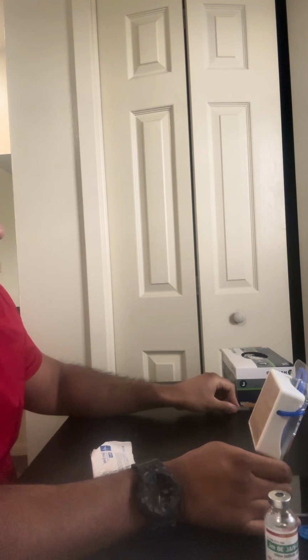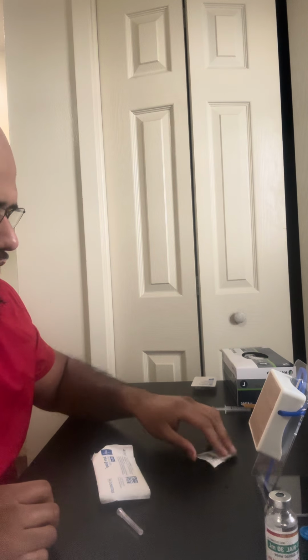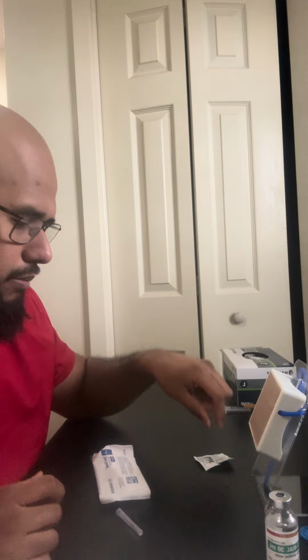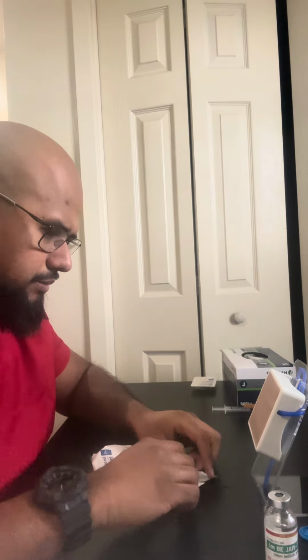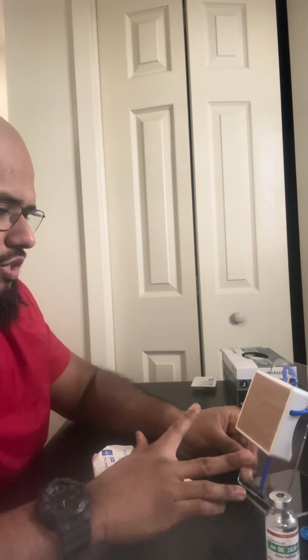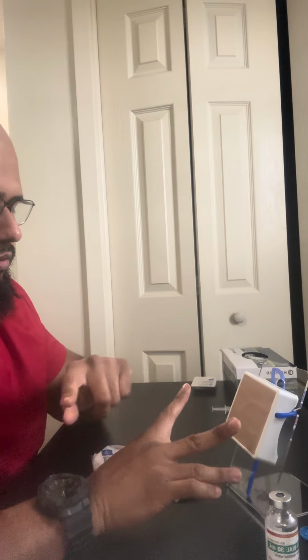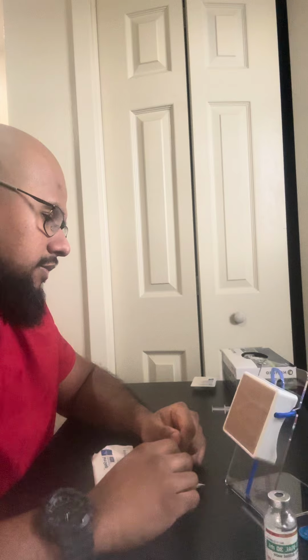You throw the needle in the sharps container, and you just wipe the site again with an alcohol pad. That's mainly it when it comes to giving IM injections. Just make sure you always aspirate, make sure you don't get any blood return, and then you go nice and slow with the medication.